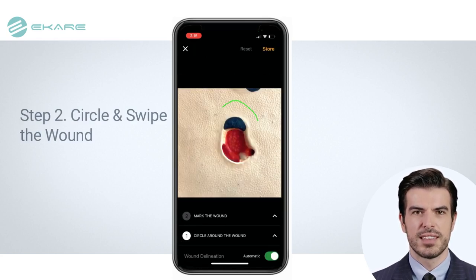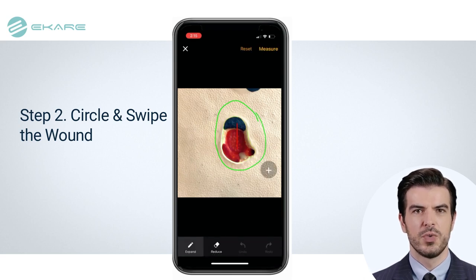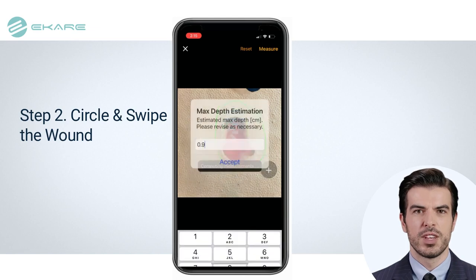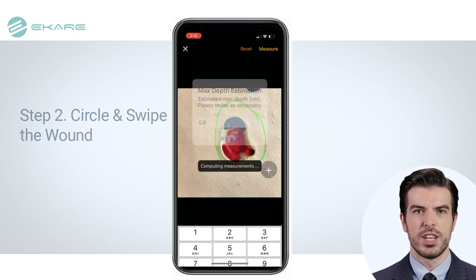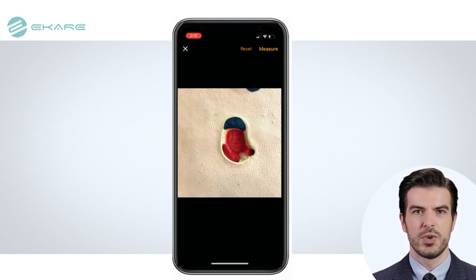In step two, circle around the wound, swipe the wound, and confirm wound depth. Insight will then compute wound measurements including wound area, volume, and color composition.